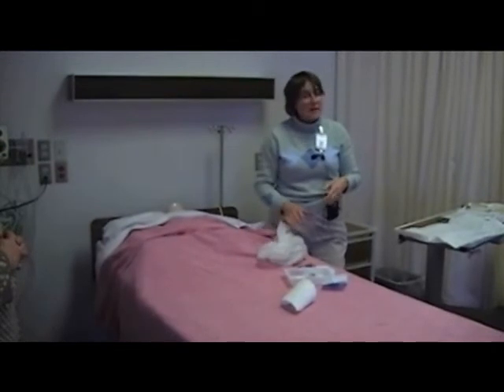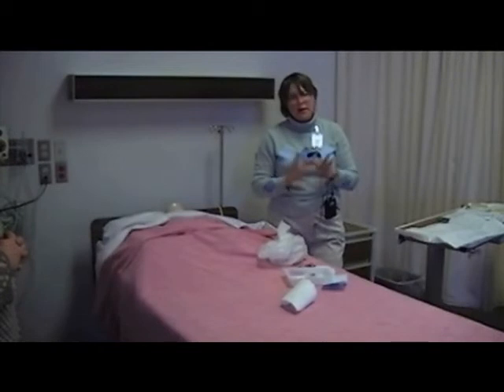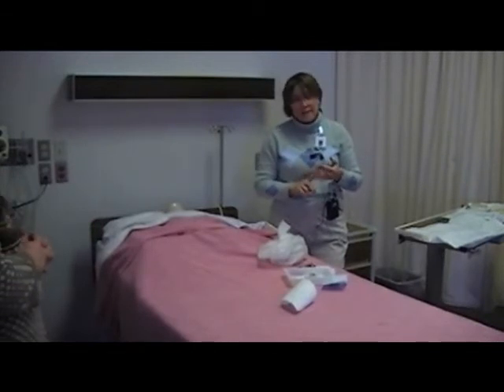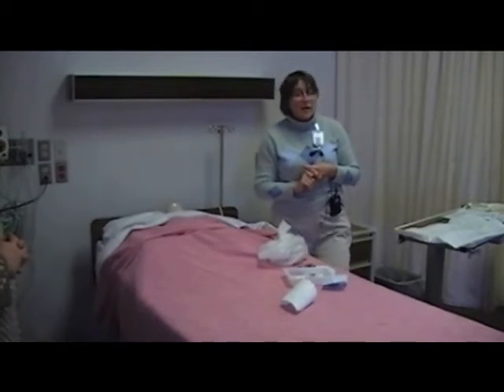So I'm going to document in my nurse's notes. It's possible that there may be another area, say on the medication sheet or somewhere in the Cardex, that you may have to document that the dressing was changed, what the site looked like, and if there were any complications that you ran into. So are there any questions at this point?